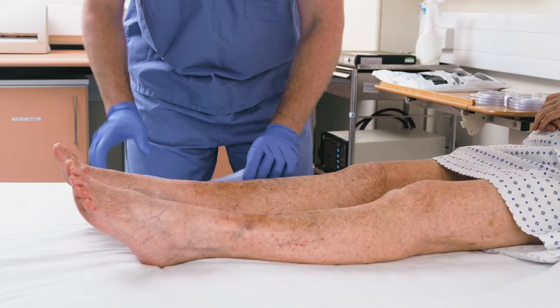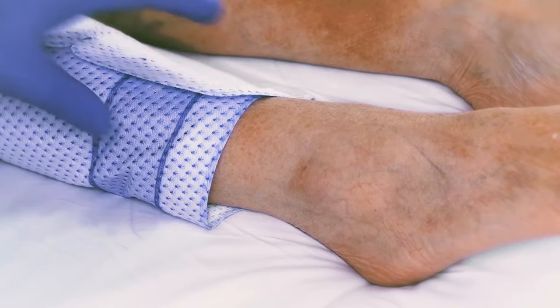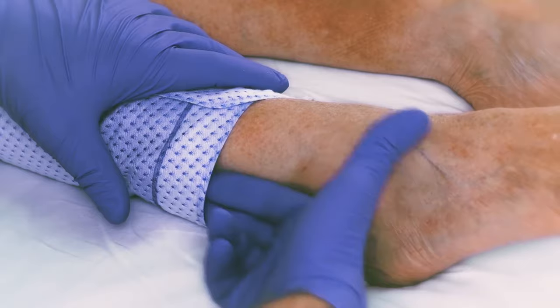To place the knee length sleeve, orientate it with the back of the patient's leg, then wrap the sleeve around the leg fastening the Velcro closure tabs. Make sure to leave approximately two fingers of space between the deflated sleeve and the patient's leg.